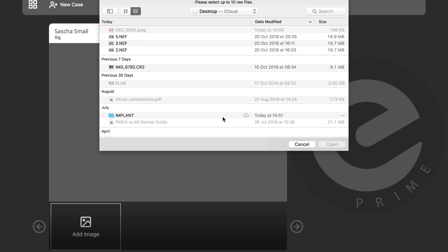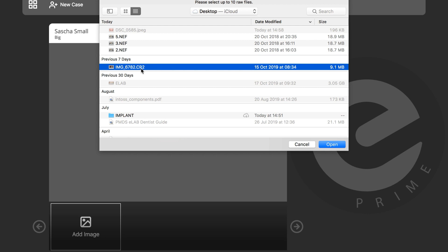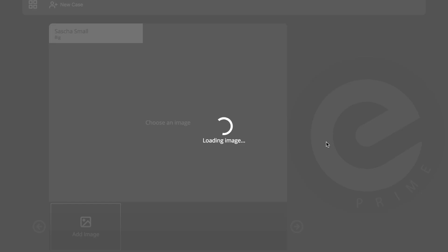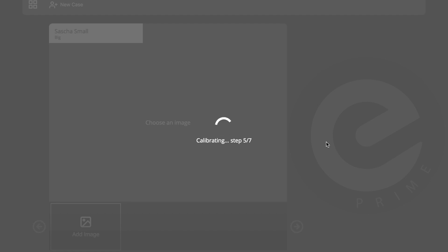The app is asking for the first picture, so we need to upload the eLAB picture taken properly with the eLAB protocol. This picture is already on the screen, so I'll click on it to open it. This takes a couple of seconds depending on your internet speed — the server is communicating with the Prime server and calibrating the main picture.